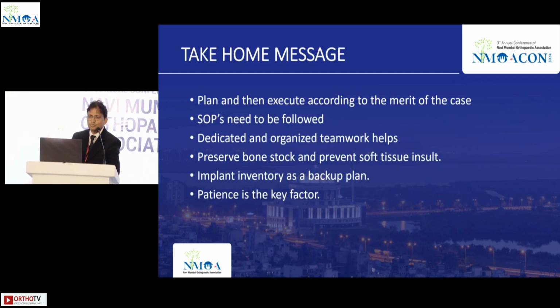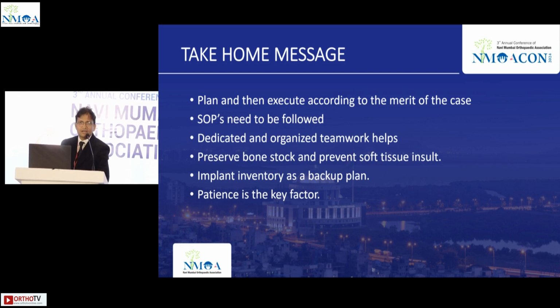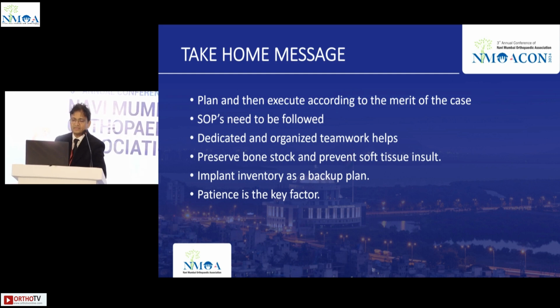And the take home has to be very simple: plan and then execute according to the merit of the case. SOPs need to be followed. A dedicated and organized team has to be there. Preserve the bone stock as much as possible. Prevent any soft tissue insults. An implant inventory as a backup plan is very important. So avoid being a freelancer surgeon for these particular cases. Patience is a key factor. Thank you. Thank you so much.